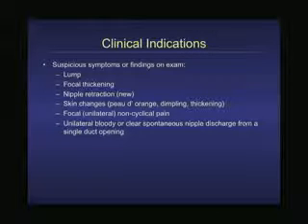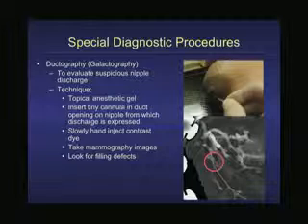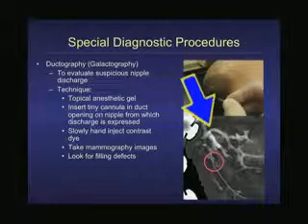And when that happens, there's some special procedures that we can do. Now, I know that doesn't look very comfortable either, but we do put some topical anesthetic gel on the nipple, and we use a very tiny little catheter that has a little hook in it, and we kind of just trace it on the surface of the nipple, and it'll fall right into that duct that the discharge is coming from. And we secure it with a little steri-strip and just slowly inject a little bit of contrast dye, and it'll fill that whole ductal system, okay?